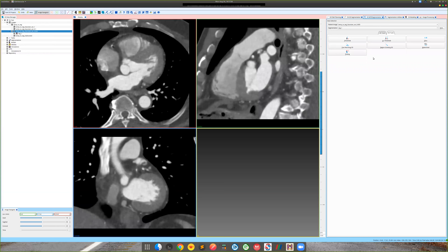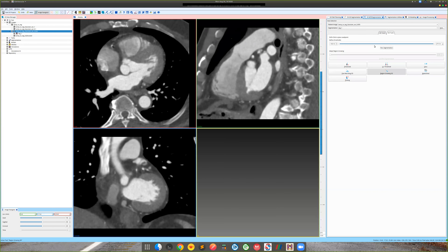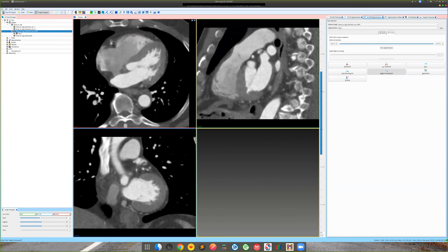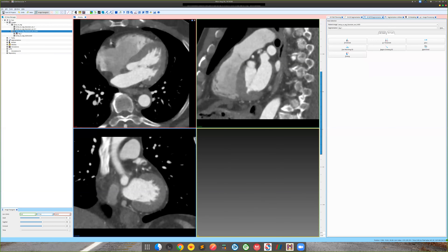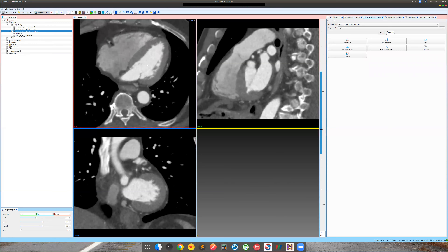Now these options are activated. There are a variety of options: simple thresholding, Otsu thresholding, watershed (an optimized method with no user-set parameters), and fast marching 3D. The one we'll focus on today is Region Growing 3D. In this method, you pick a seed point and the algorithm grows from there, including all regions within a threshold of the intensity. Before we do that, let me go over which regions we want to include and how to choose the thresholding.